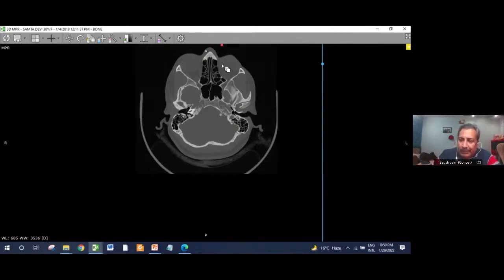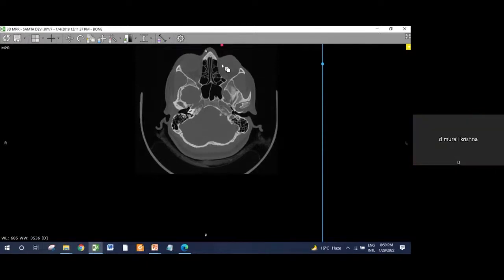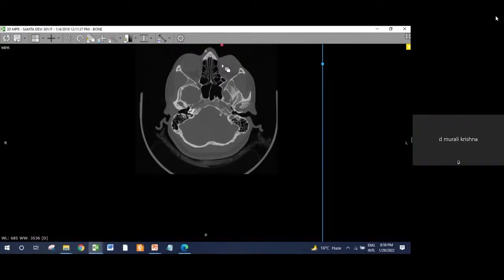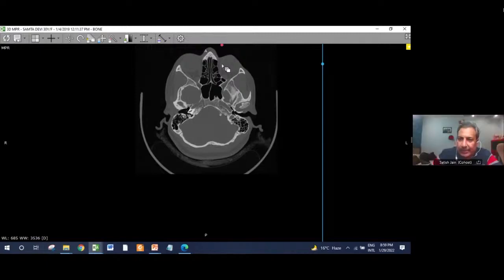Okay, sir. Bottom line is, your radiologist can't give all this in your report. Really? Yes. You have to see it dynamically yourself. So it is not a fault of the radiologist, I would say. It is a need of the time for the surgeon to understand themselves to relate in surgical planning. In surgical execution, this is like a Google map, wherein you can use all these fine details, dynamic information to translate into surgical execution. Okay, sir. Thank you, sir.